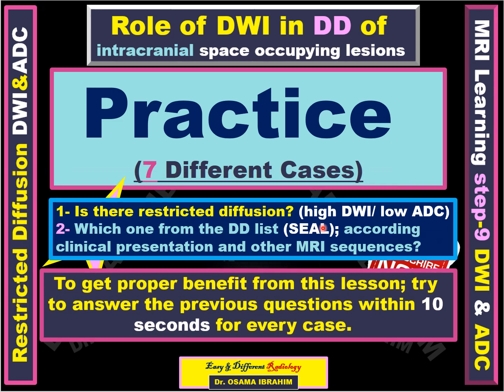To get benefit from the presentation, you should try to answer these 2 questions, to discriminate whether there is restricted diffusion or not, and to reach one from the other according to clinical and other MRI sequences within 10 seconds, and I will make timers for that for every case. Okay, so let's get started.